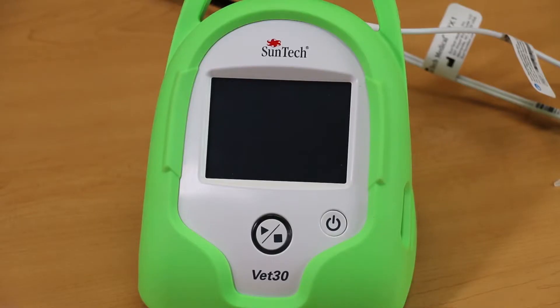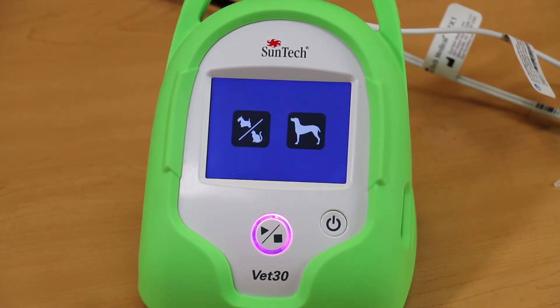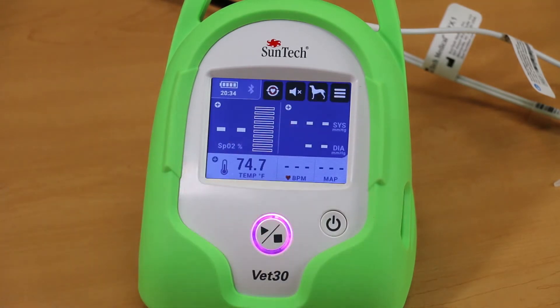Turn on the monitor and select the size of the patient you are monitoring. Small animal mode should be chosen when taking BP measurements on cats and dogs up to a number 3 cuff size. Large animal mode has been designed for animals requiring a number 4 BP cuff or larger.